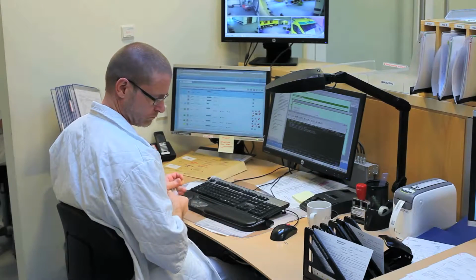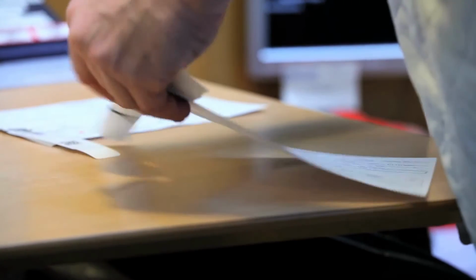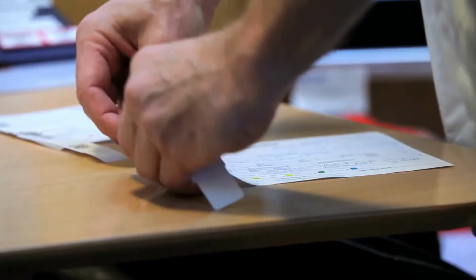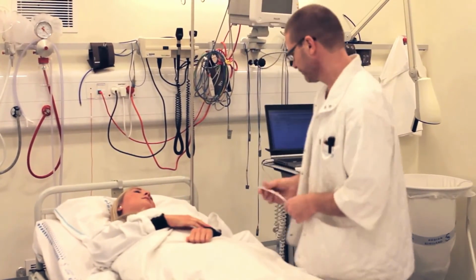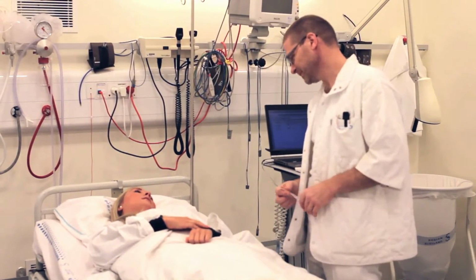First of all, we obviously use the wristband to ensure that we also have the right patient. We usually have the wristband in our hand and ask the patient whether they are the person stated on the wristband. This is confirmed by the patient, a relative, the emergency services, or someone else. After this, the wristband is usually used any time we have contact with the patient. The wristband is attached securely around the patient's wrist, with all the patient's details, including their treatment, usually when in a bed.